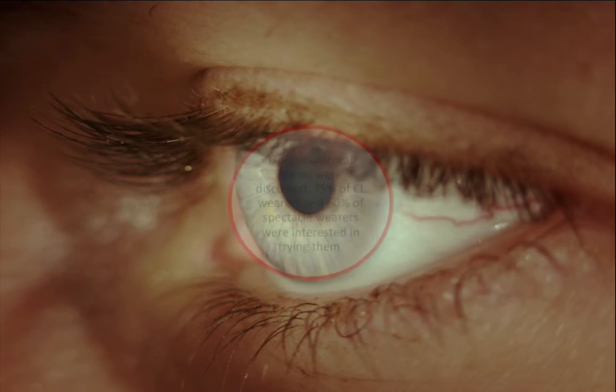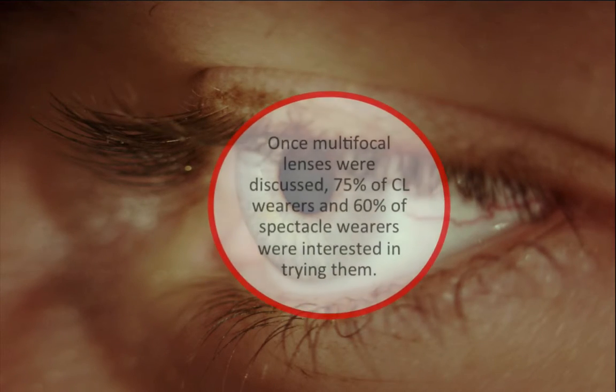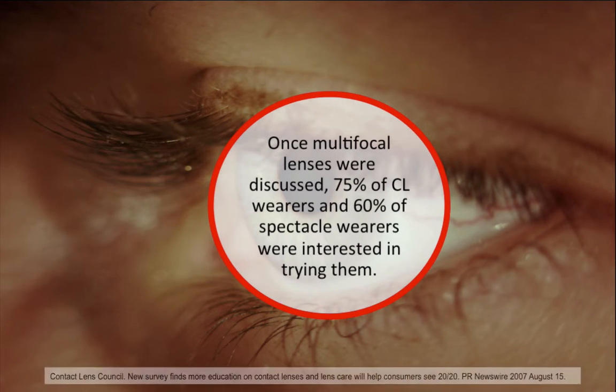With glasses, they either are going to have to compromise with readers or utilize progressives, which limit the field of vision that they're used to. When it comes to contact lenses, we eagerly offer them to our emmetropic patients. But doing so always requires setting the proper expectation.